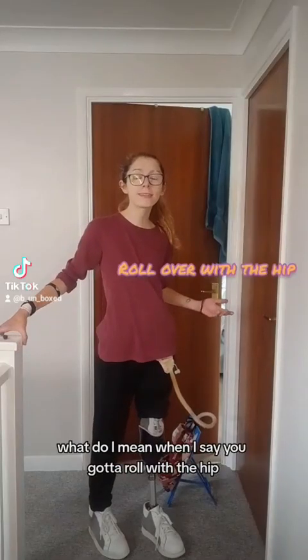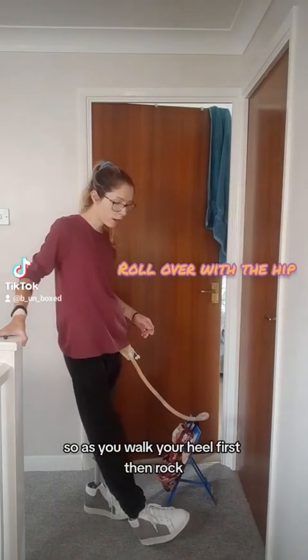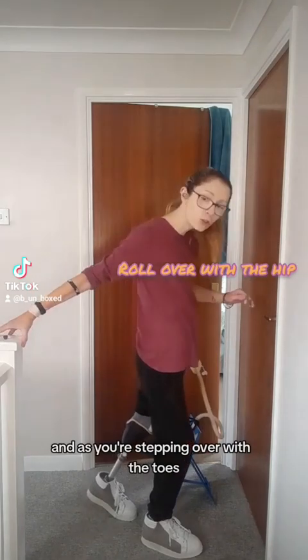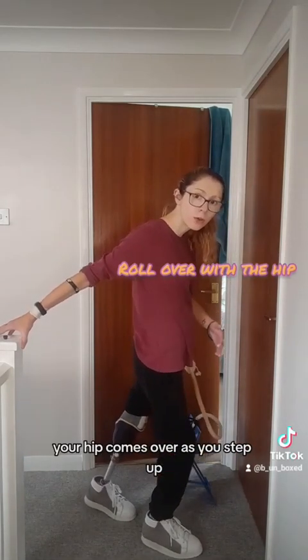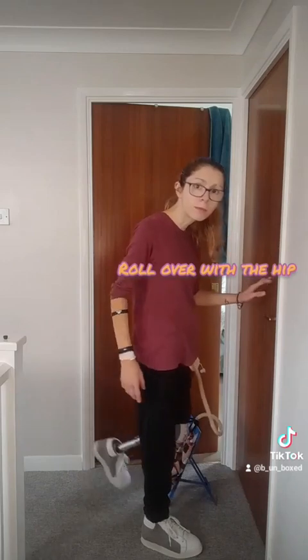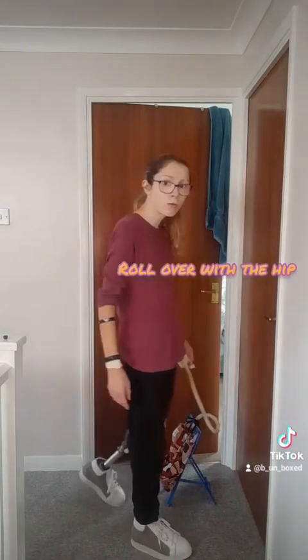What do I mean when I say you roll with the hip? So as you walk, you're heel first and you walk. As you're stepping over with the toes, your hip comes over as you step up. So it basically goes: walk up.